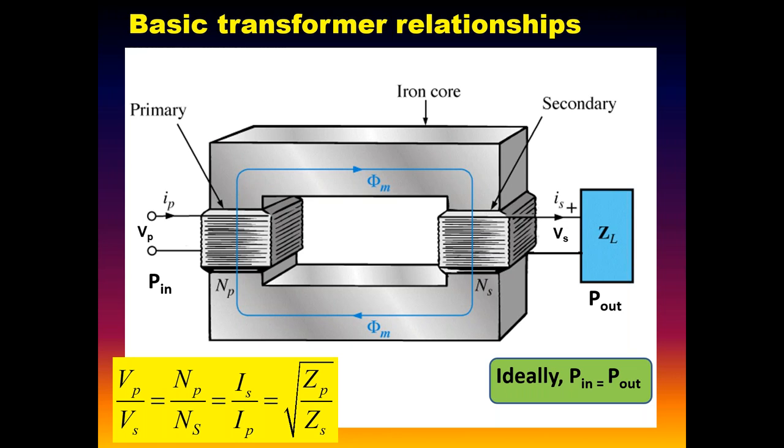You remember something about your transformers? These are passive devices, again, relatively simple. We've got them everywhere, obviously. There are coils of wire on the primary side, a number of turns, and on the secondary side, a number of turns. It's the ratio of those turns of wire that determines whether the transformer is a step down, whether it steps up, or in the case of isolated power, like some of our ORs we still have, if your cath labs have isolated power, 120 in, you get 120 out. So the number of turns are the same.